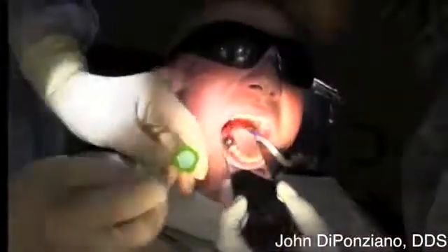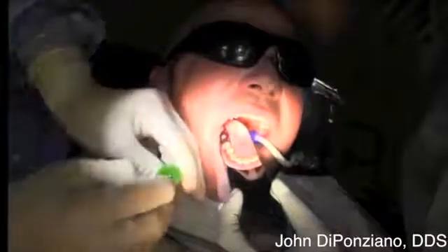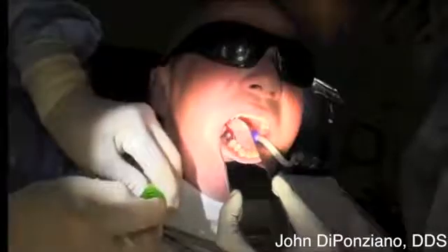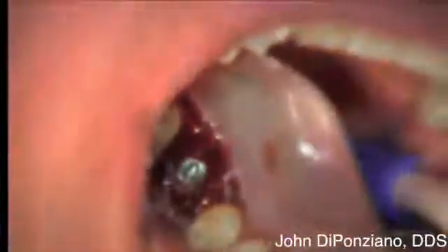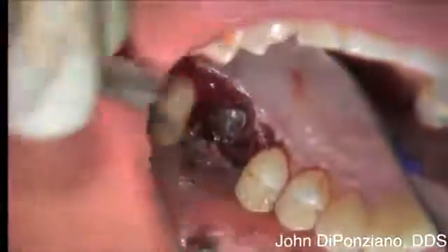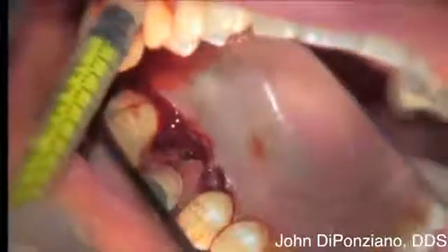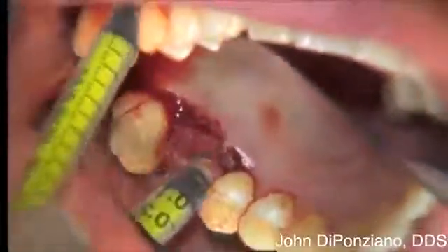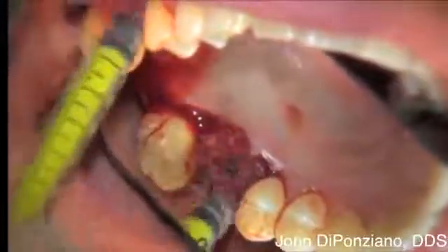Now we're going to place the cover screw. I hold the vial in my left hand, then pop off the cover screw lid with the little hand wrench. Pick up the cover screw — because the hand wrench is tapered, it wedges on so the screw does not fall off the wrench — and take it to the implant and tighten it down with finger pressure only. A little extra bone is placed to fill some of the socket area, any little defects, and also the defect at the mesial of the second molar.